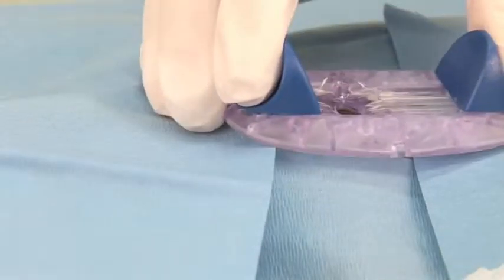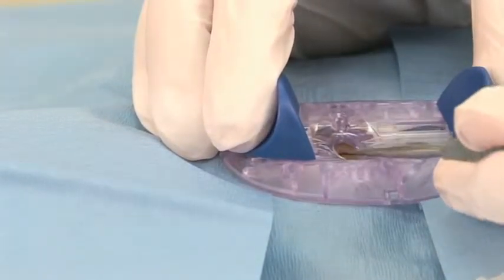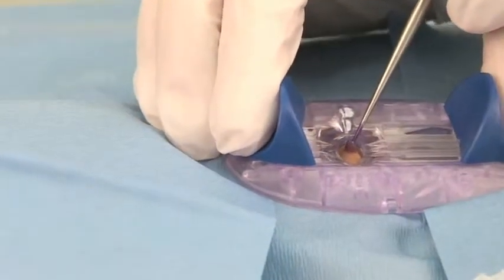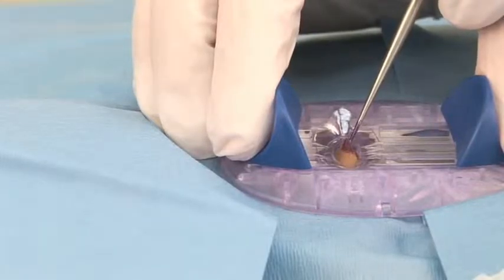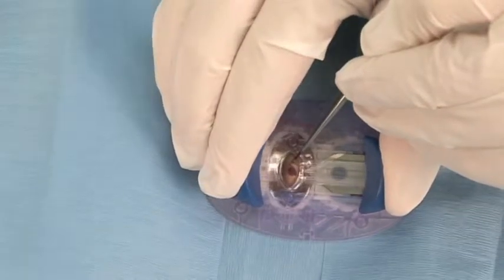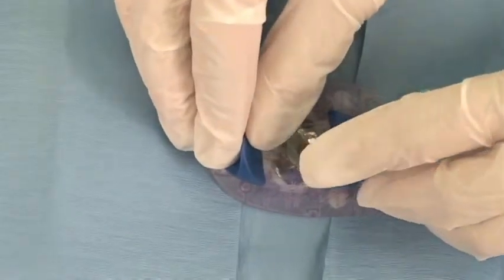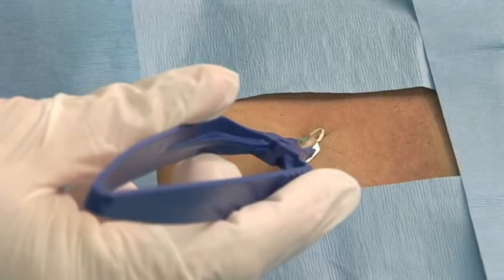Next, the ExeClip is positioned with the aperture aligned over the lesion site. The skin is then gently pulled through the opening and positioned to visually confirm the lesion is above the plane of the blade. As the finger and thumb grips are simultaneously squeezed, the lesion is removed and the site closed with a skin closure clip. After 10 to 14 days, the skin clip is removed with a simple removal tool.